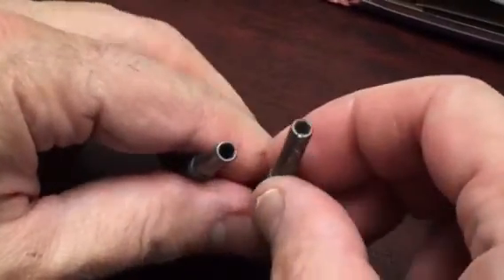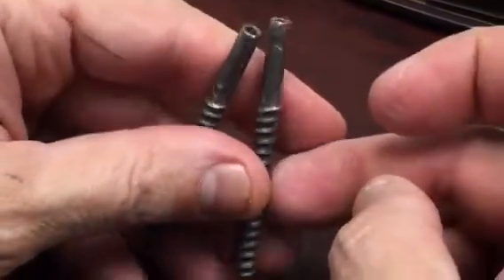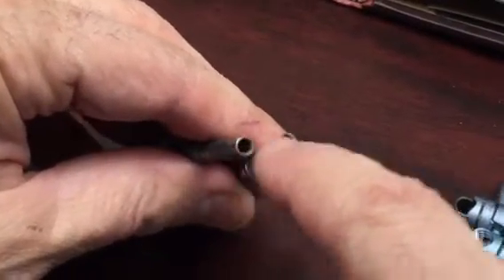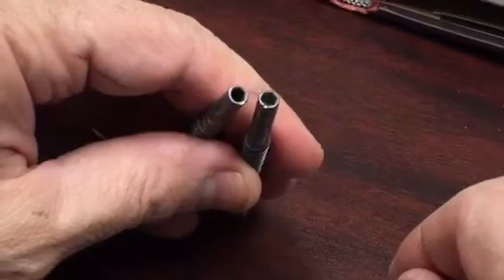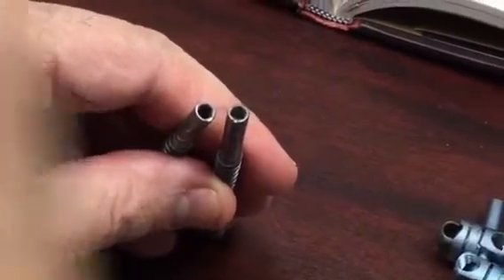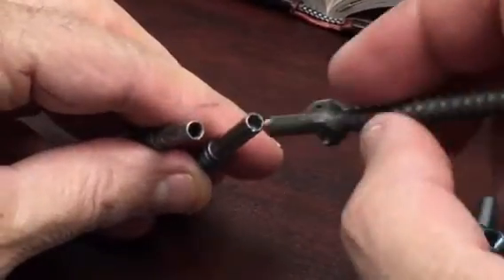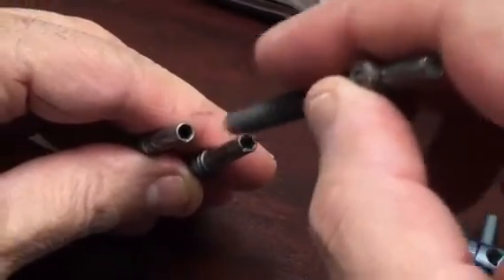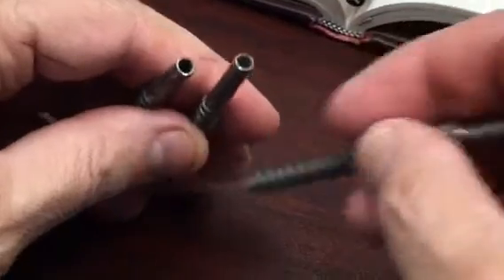That leaves you with the screws, which are just these posts. They have a specific driver, which is a hexagonal driver, to take these posts out. The other thing you can use if you strip it is a five millimeter Synthes reverse screwdriver removal kit, which will take these things out.